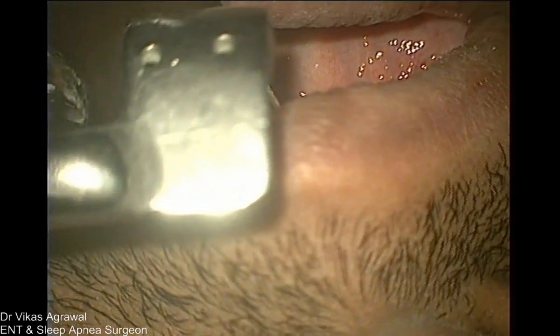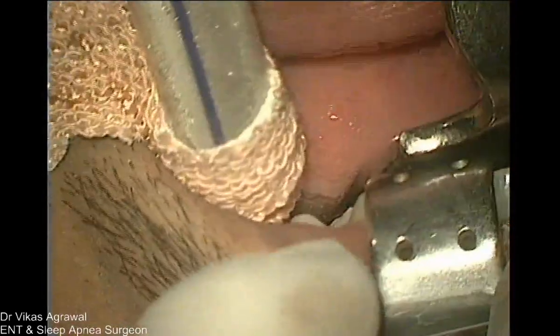Now, there are multiple desaturation indices which have been used. So there is a 4% index and a 3% index. If the patient's baseline saturation is say 97%, and his saturation falls by about 4%, the monitor will pick it up as an event. It may so happen that each apnea, especially in a younger individual, and each hypopnea may not cause an oxygen desaturation.